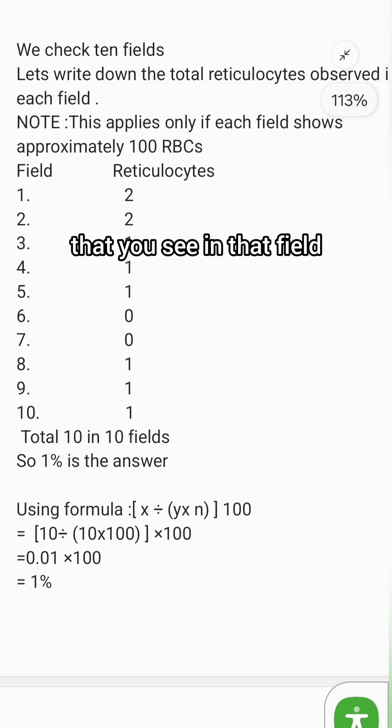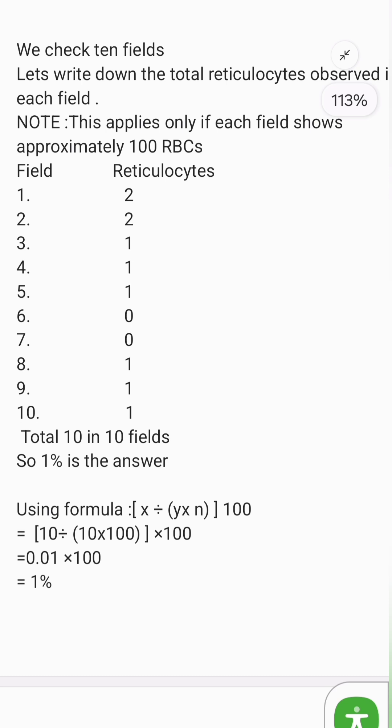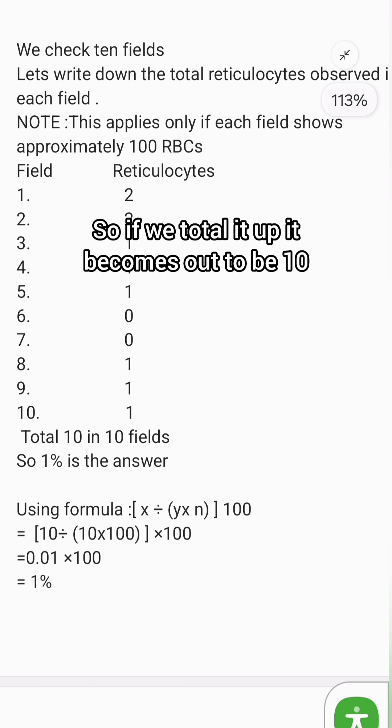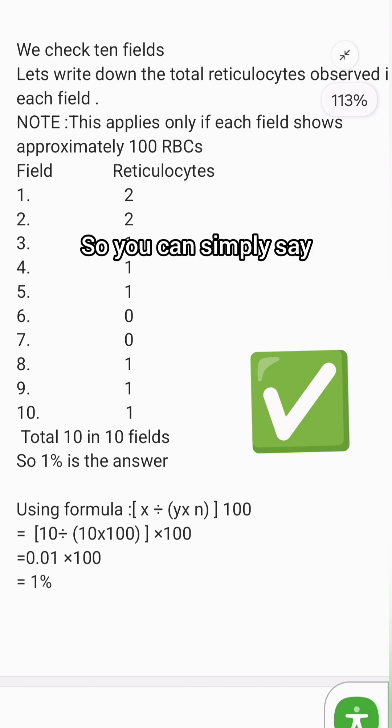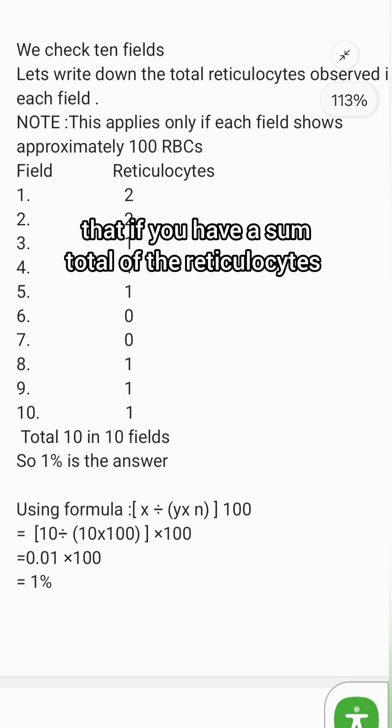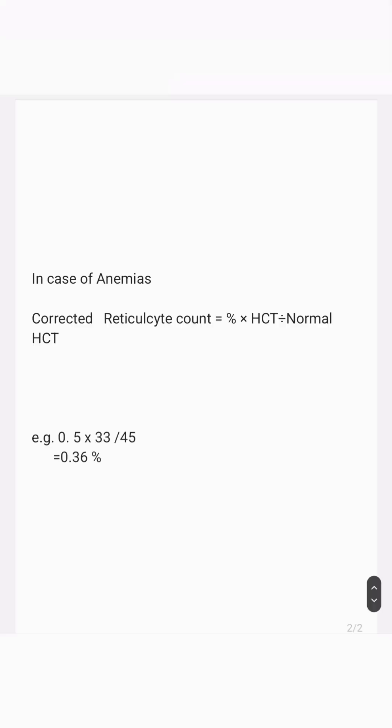Note that this formula I'm applying is for 100 RBCs per field, and I have written 2, 2, 1, 1, 1 as the number of reticulocytes. If we total it up, it becomes 10. So using the formula x ÷ (y × n) × 100, it comes out to 1%. You can simply say that if you have a sum total of the reticulocytes, just remove one zero and you get the answer in percentage.